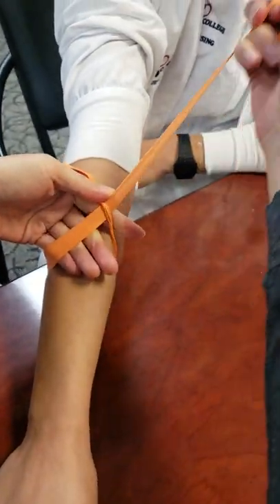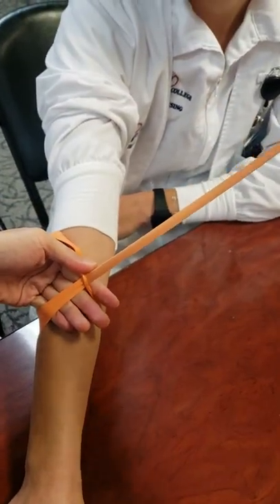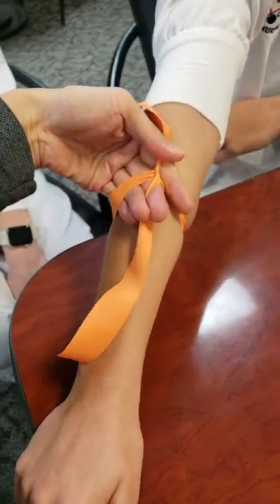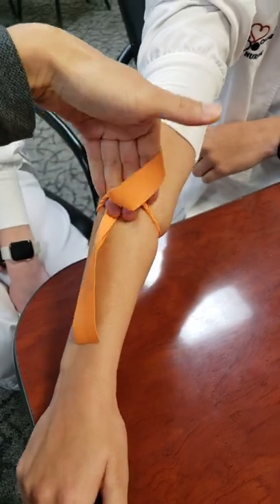This one is a little loose, so I'm pulling this up a little more and then giving it to the third and the fourth finger. What I do is I just pull it up.